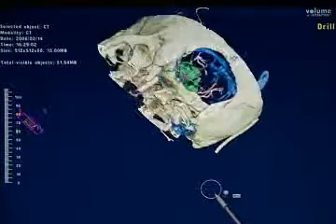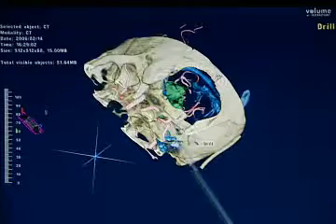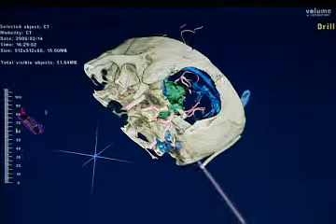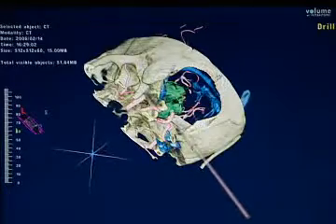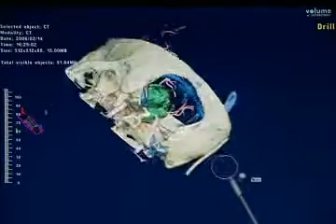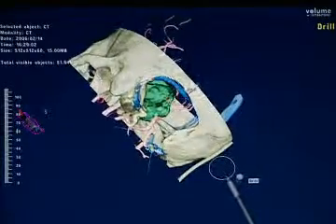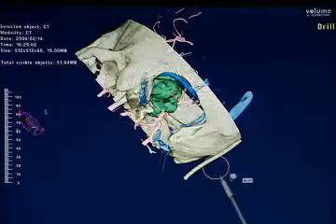And what about trying to do a far lateral approach? Again, you can do a far lateral approach. You can see the condyle just out here. And of course, because the tumor is very low, we may want to know whether a far lateral approach would be useful in this situation. It may be useful because as you move in now, you can see the close relationship with it and the vertebral artery. And if you want to dissect it, that may be an alternative you can do.